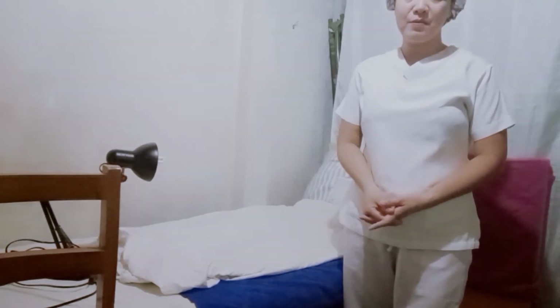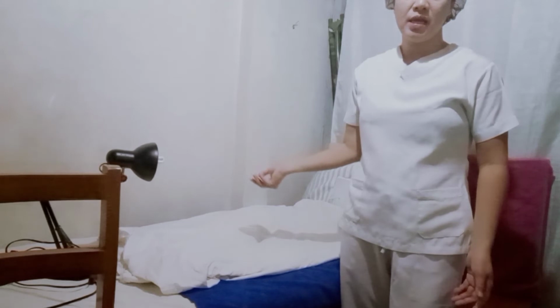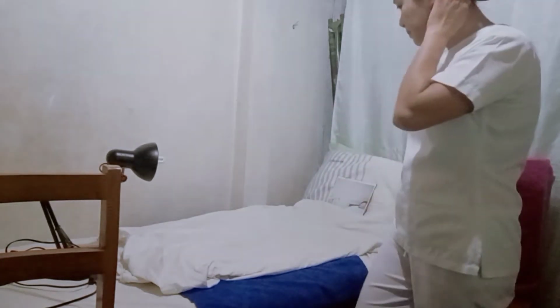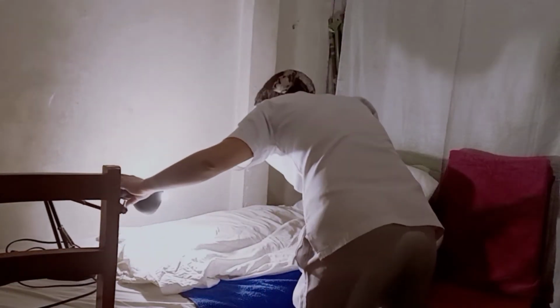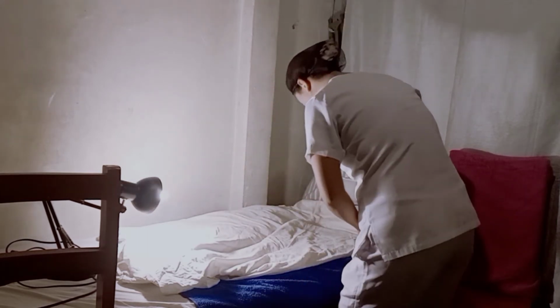Number 5 is to place a light to enhance visualization. This promotes identification of the anatomical parts. Excuse me, Mom, can I open this? Because I am going to perform a catheterization for you today.